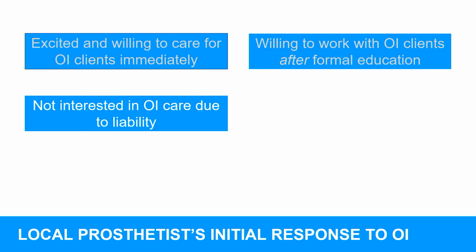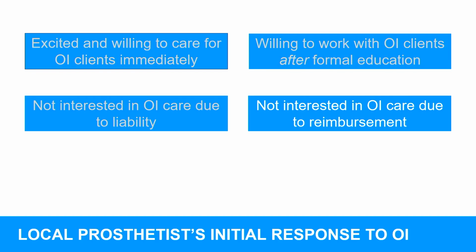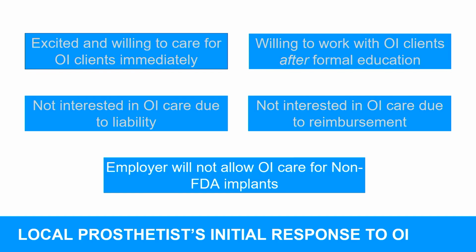The third group says, I'm not interested in OI care due to liability. The fourth says, I'm not interested in OI care due to reimbursement. And the last group says, my employer won't allow me to work with non-FDA approved osseointegration.